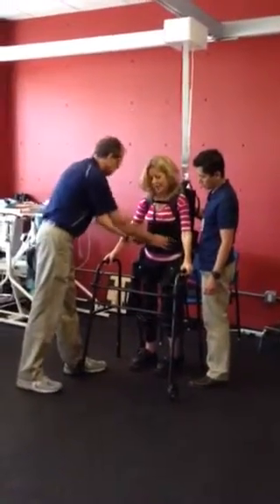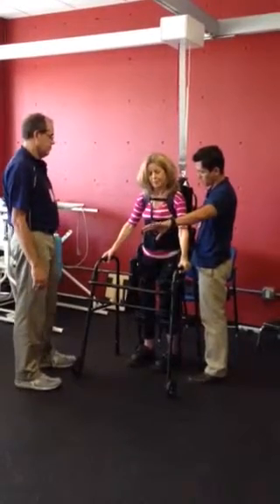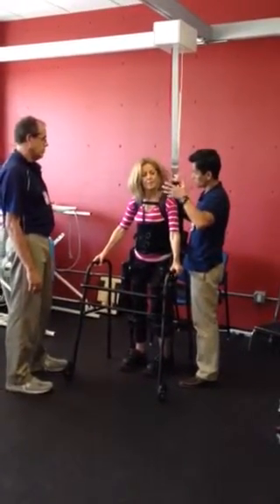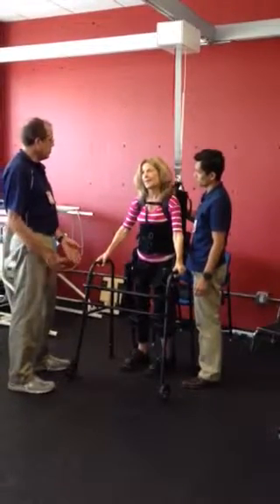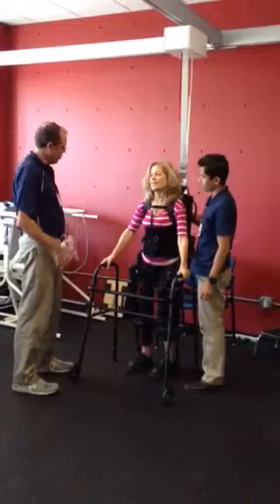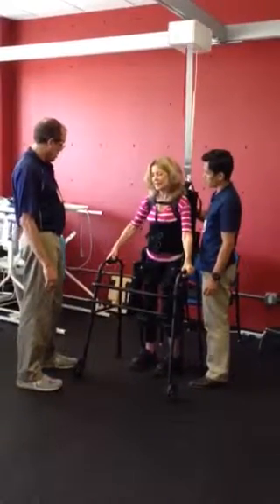Feel snug in here? Is it okay? It's okay. Ready? Sometimes, because you're not used to being up, you have blood rushing down from your head to your muscles. So you can get a little lightheaded — it's just like that for you.